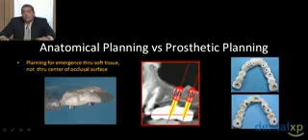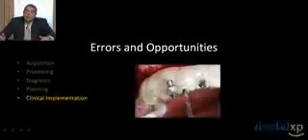Rather, it's the cervical position of that implant as it emerges through the soft tissue that's going to determine the aesthetic value, or the potential possibilities of aesthetic value, of that tooth. So it's really the underside of the surgical guide that you should be looking at in terms of proper positioning of your implant, as opposed to the occlusal surface of our guides.